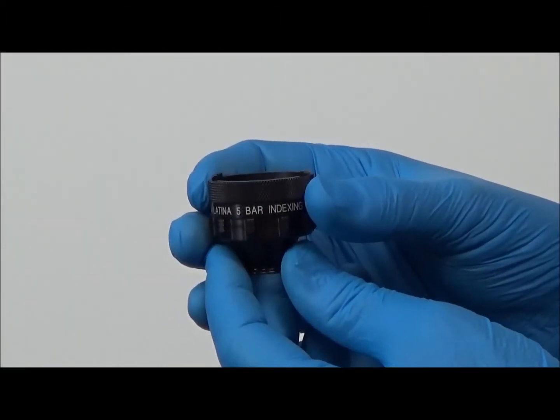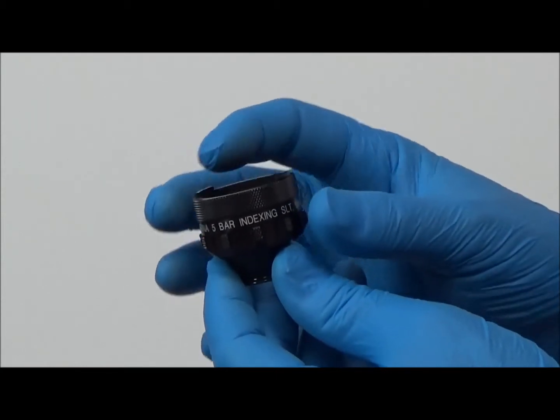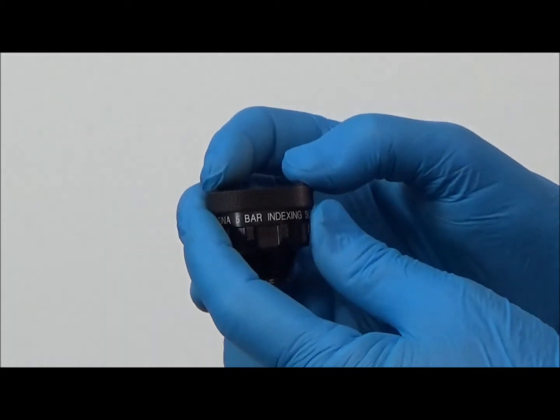To disassemble, press the opposing tabs together and slide off the anterior knurled rim.